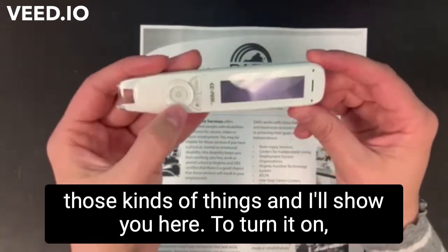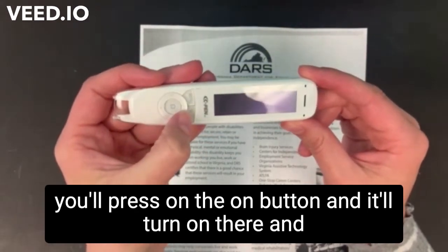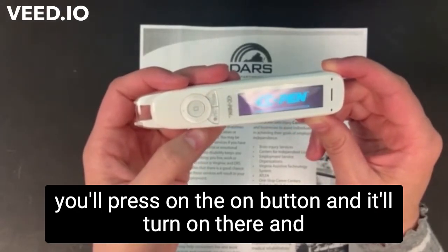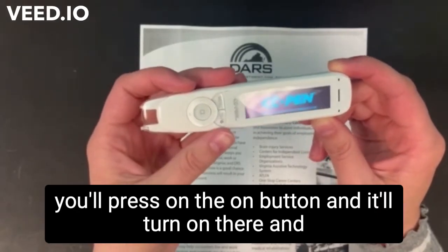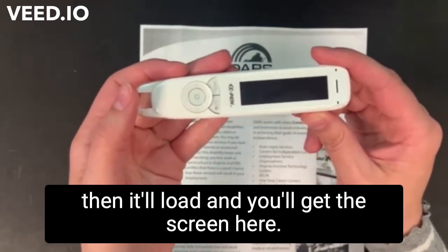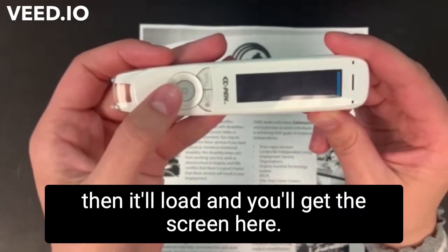I'll show you here to turn it on — you'll press on the on button and it'll turn on there. And then it'll load, and you'll get the screen here.